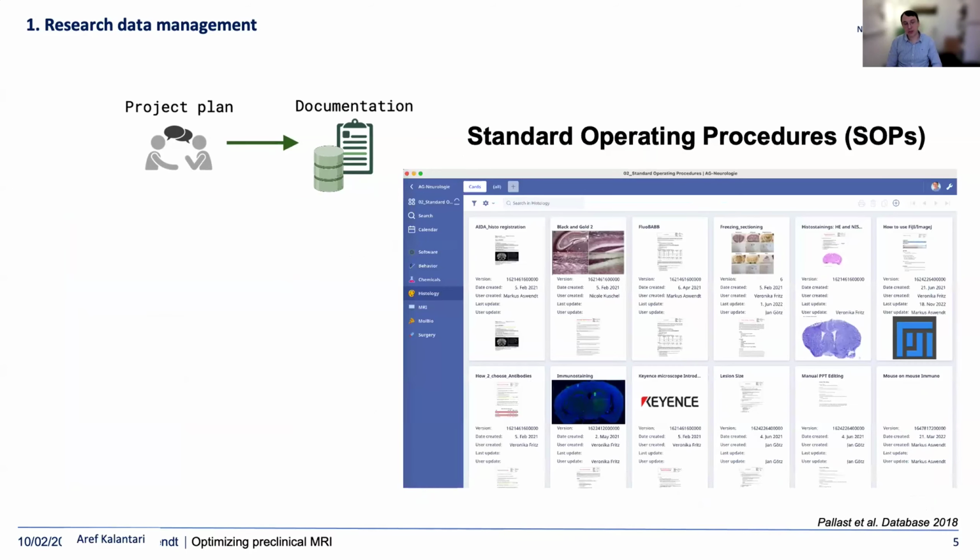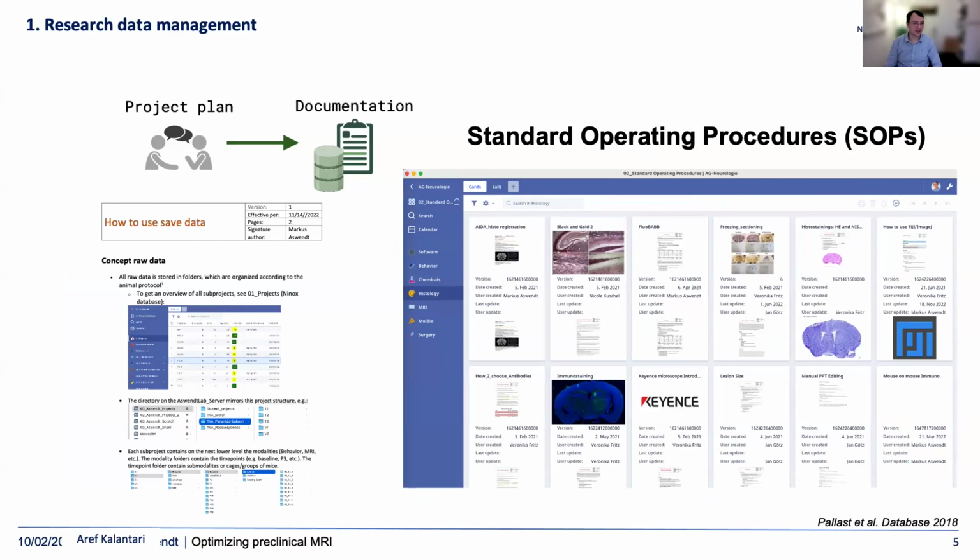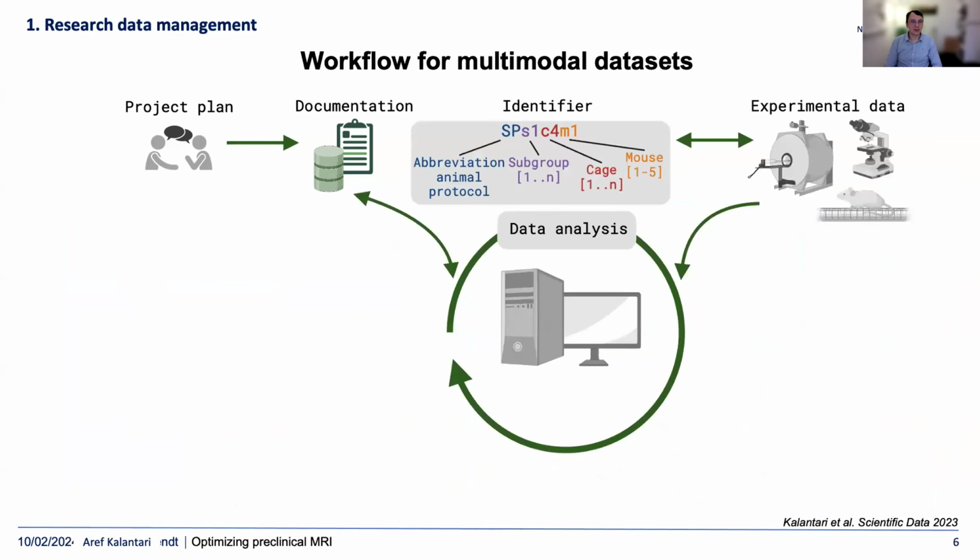We have standard operating procedures. Sounds very trivial, but in the end, this is not trivial at all, especially when it comes to keeping them updated and keeping them actually used by people in the lab, especially if you have a frequent turnover of students, as I do. So you can call me pedantic. I even have SOPs for the students on how to save data.